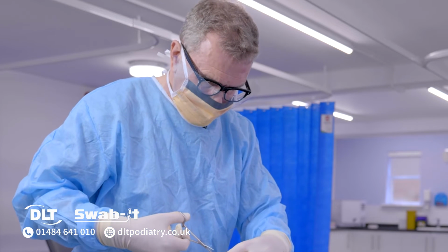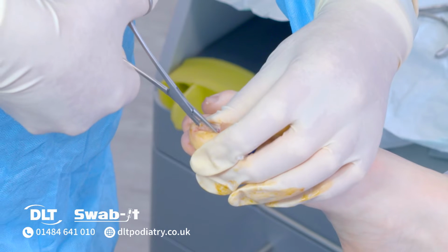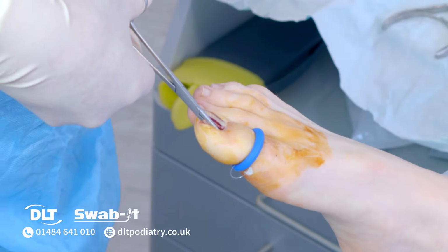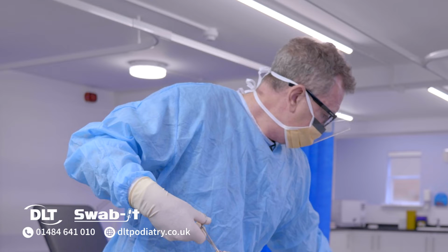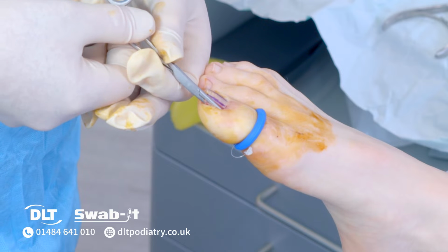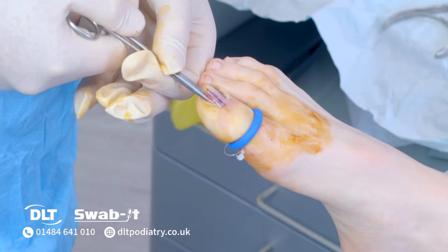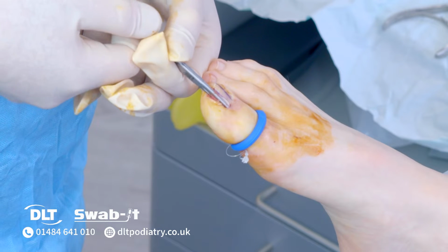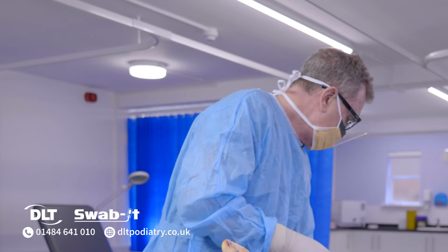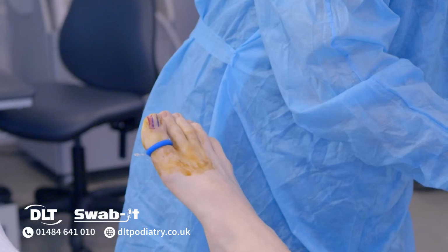Then you take your Spencer Wells forceps. Again, elevate your arm to try and get right under that eponychium. Grasp. Remove your fingers and you rotate towards the middle of the nail plate gradually. Use it like a turning fork, and you gradually rotate to the middle line, and you get a clear wedge resection.